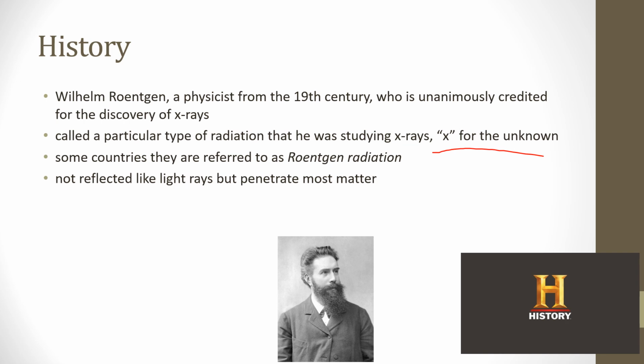Not reflected like light rays, but they penetrate most matter. And based upon the type of matter the X-rays are going through, it's going to show up differently on the film. So it depends on the density. The more dense it is, the more it's going to absorb the X-ray.